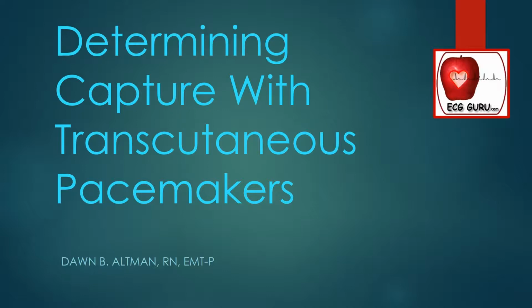Today we're going to talk about determining capture with transcutaneous pacemakers. Transcutaneous pacing is underutilized. I think one of the reasons is it can be very difficult sometimes to determine whether there's capture. Some people are afraid to raise the mA enough to obtain capture, and if they feel they're not having success with the pacemaker, they're very quick to just turn it off or stop using it.